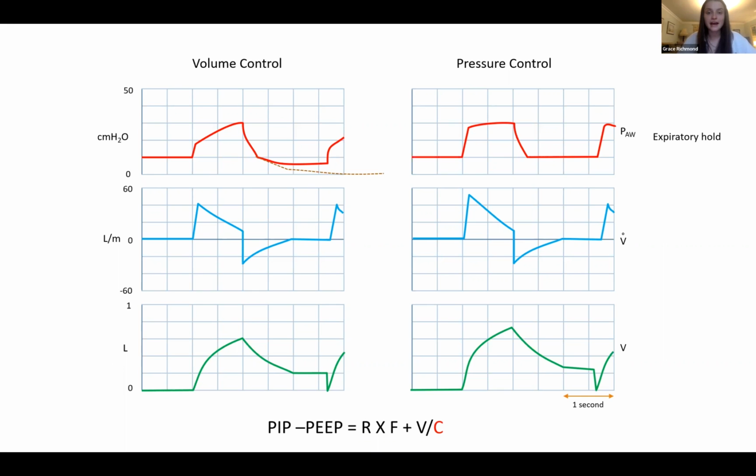So moving on, another question. Would we prefer oxygenation to ventilation while losing PEEP, specifically in ARDS with severe hypoxemia? Well, this is the most difficult clinical scenario that we encounter. I think Salma asked this question, right, Dr. Salma?